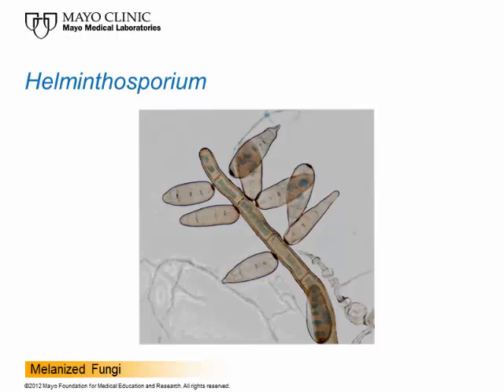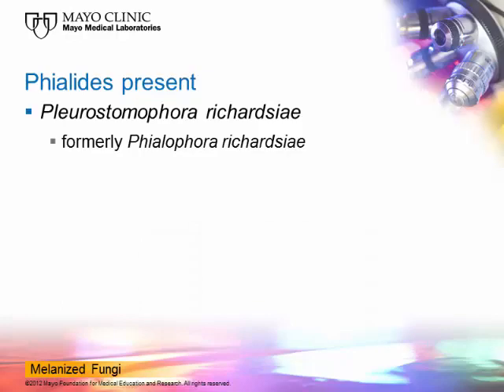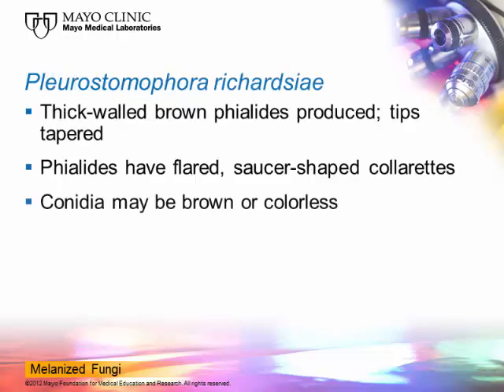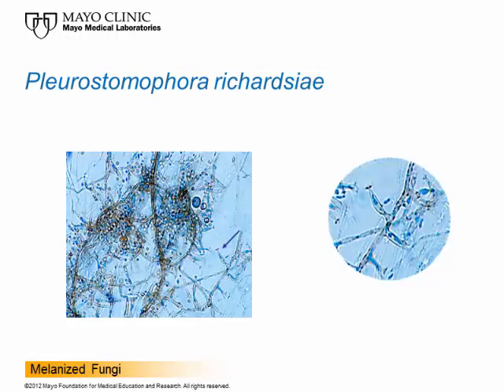There has been a name change for the next organism: it used to be called Phialophora richardsii and is now called Pleurostomophora richardsii. It produces phialides — flask-like structures that produce conidia. This organism causes phaeohyphomycosis fairly commonly. Thick-walled brown phialides are produced with tapered tips that have a flared area at the top looking like a saucer. You may find brown pigmented conidia or some that aren't pigmented at all. The right-hand side shows the phialide with the saucer-like tip where conidia are produced and kept in a mucilagenous cluster together.